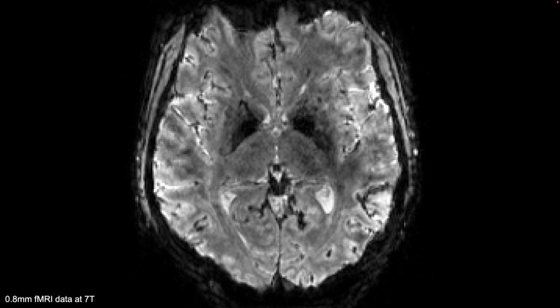Many of us care about high resolution fMRI, and we are working with data like this. And these data look nice, don't they? They are kind of high resolution. You see how we have multiple voxels across cortical depth. You can see these anatomical or angio-architectonic features, that we have these large draining veins visible individually. We have these details like the optic radiation directly visible in EPI. And data like this have gotten us very, very far.